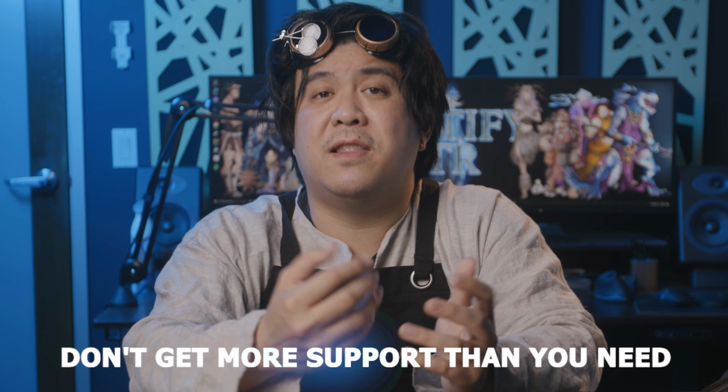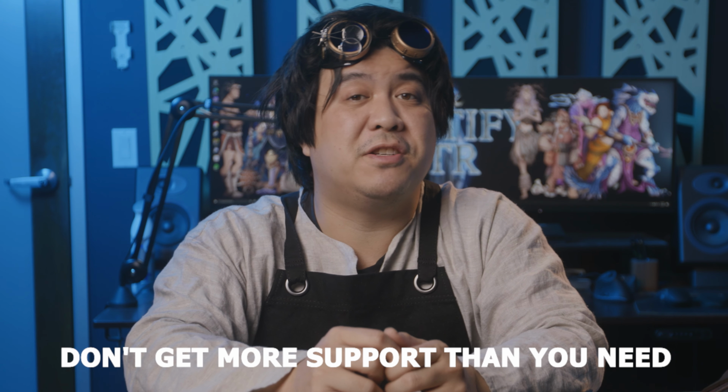If your symptoms aren't that bad and you're looking for something to just relieve some achiness or pain, then something like a compression glove or even a wristband may be just what you need. There's no reason to limit your mobility if it isn't something that you strictly need. Now that you have the answer to these questions, let's get to the braces.